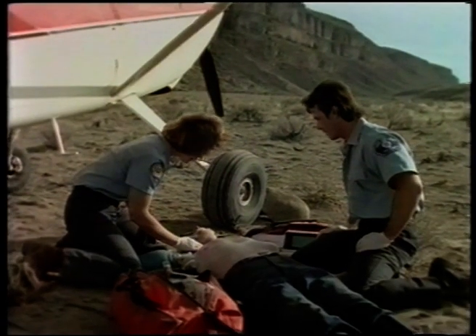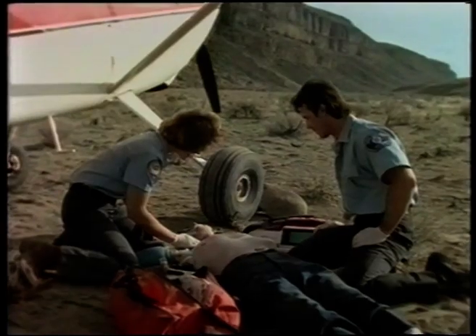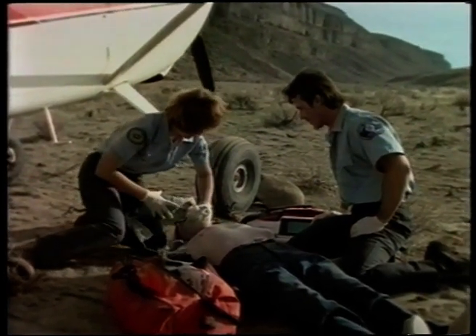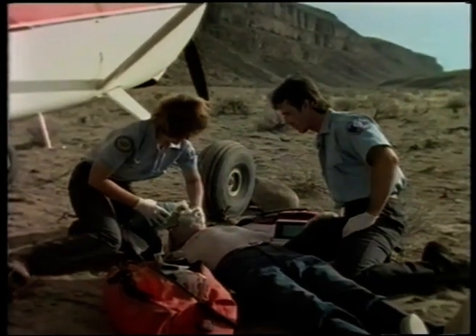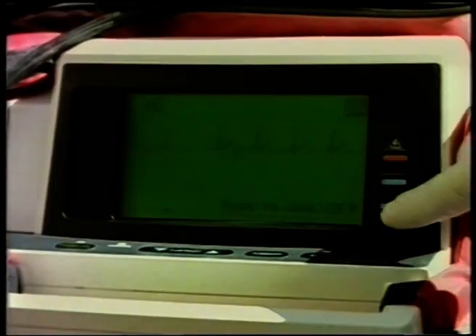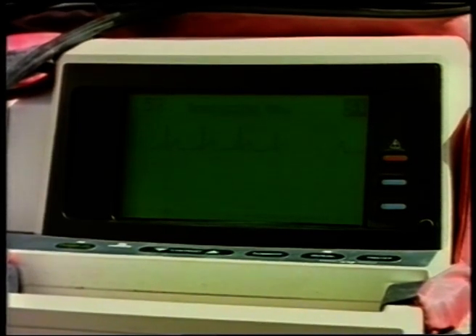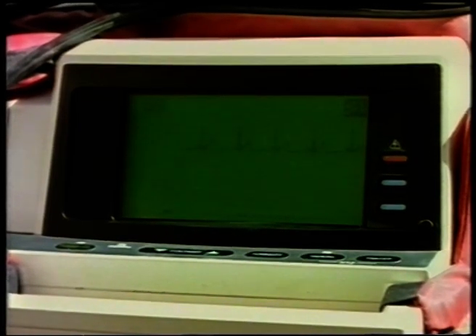After the third shock, check the patient's pulse. If no pulse, perform CPR for 1 minute, or per local protocol. Check for a pulse again, and if no pulse, push the Analyze button and deliver up to 3 more shocks, if advised, for a total of 6 shocks or per local protocol.